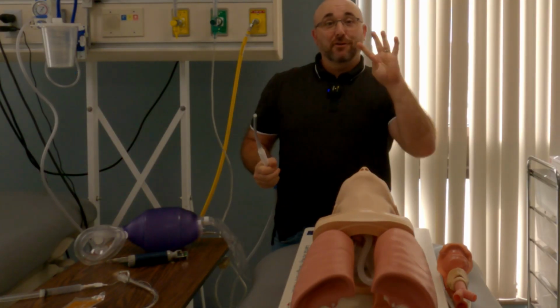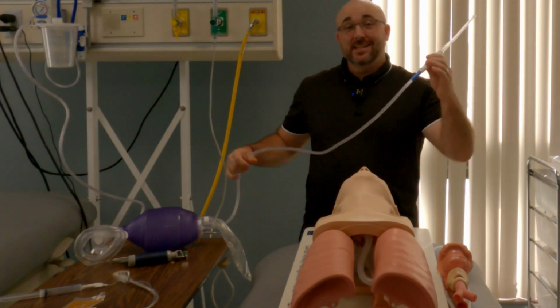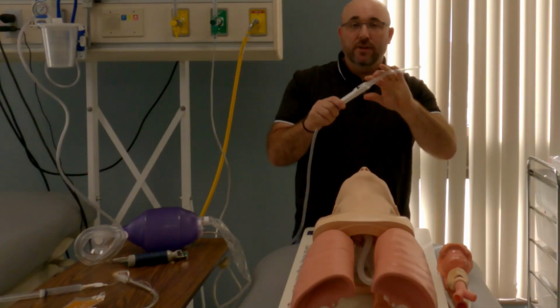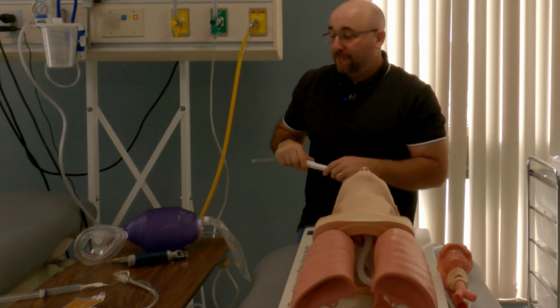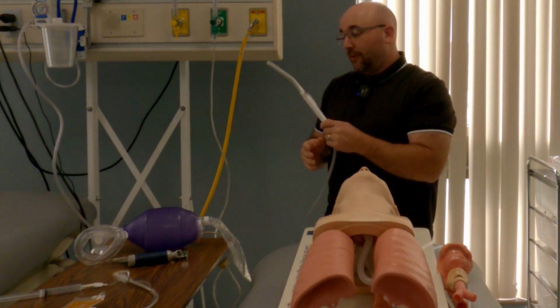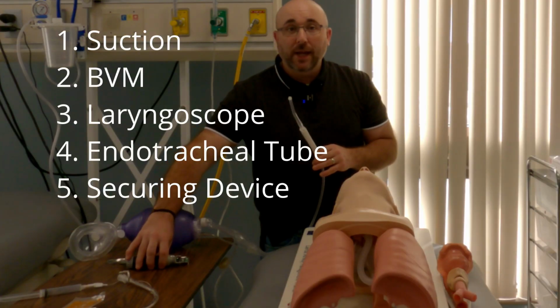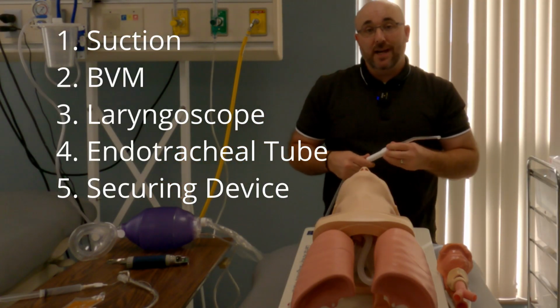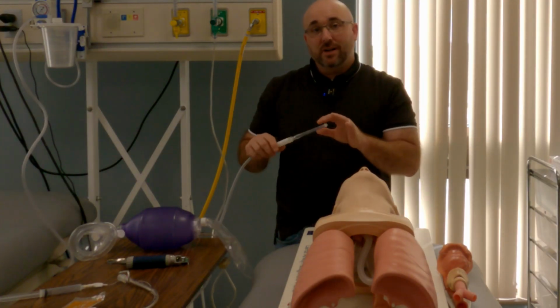So I did say there were 4 things. There's actually 5 things. So the 5th one is having suction set up with a rigid tonsil tip. We can call this a Yankauer or whatever it may be, making sure suction is functioning. These are the 5 different pieces: suction, bag valve mask, laryngoscope blade and handle, endotracheal tube, and then we have our securing device. Those 5 things, and I'm going to do them in order, is what you're going to need if you're assisting.